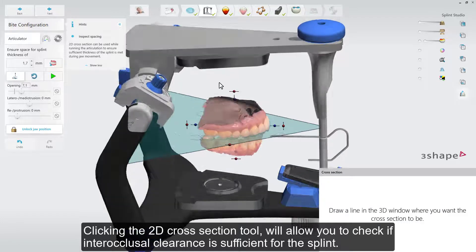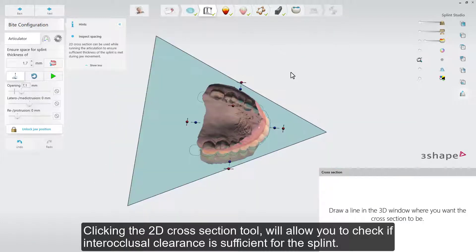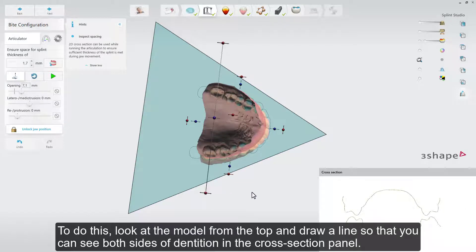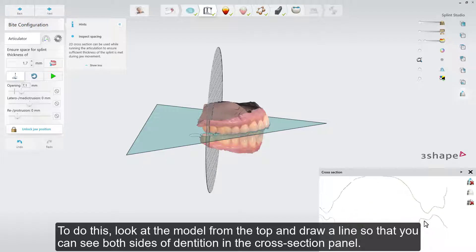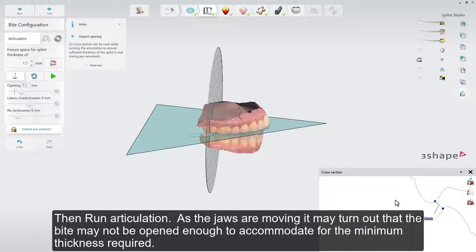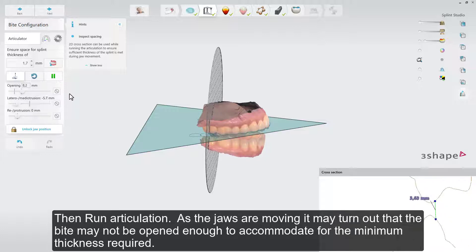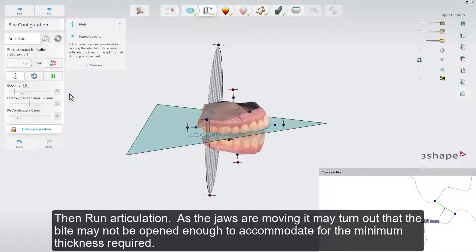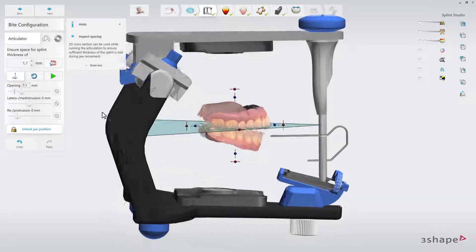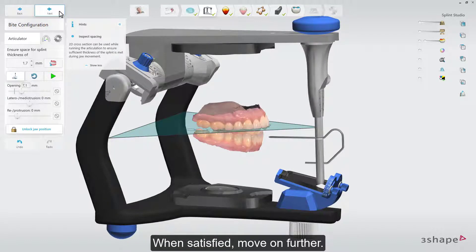Clicking the 2D cross-section tool will allow you to check if inter-occlusal clearance is sufficient for the splint. Look at the model from the top and draw a line so that you can see both sides of the dentition in the cross-section panel. Use the control points to move or rotate the plane if needed. Find the narrowest point of the cross-section and take a measurement to check it. Then run Articulation. As the jaws are moving, it may turn out that the bite may not be opened enough to accommodate the minimum thickness required. When satisfied, move on further.